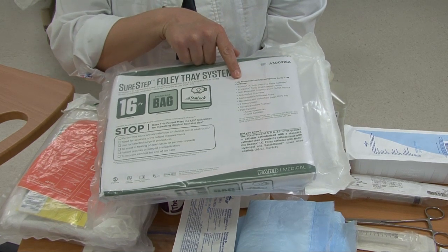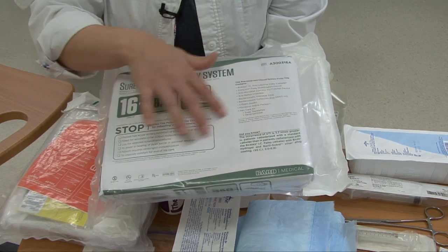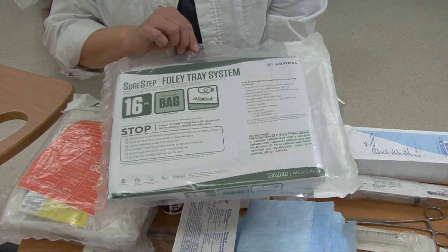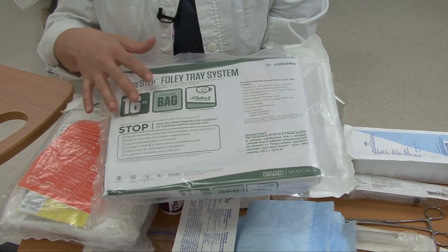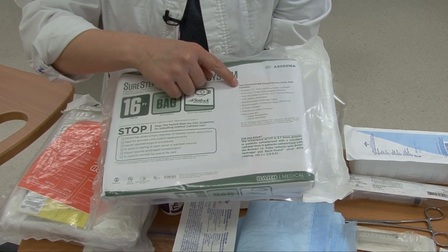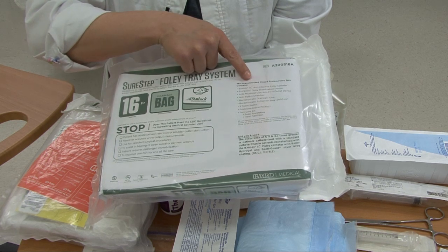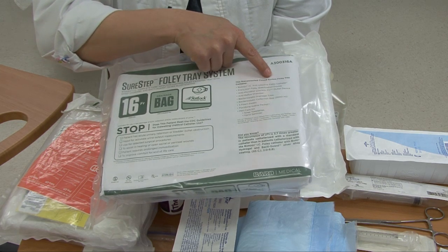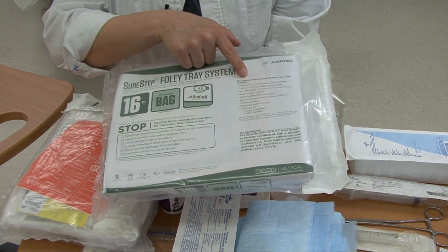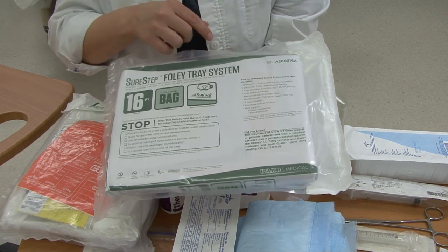You always want to examine your package before you start to make sure it is clean, dry, and intact and within the expiration date, but also review what's in it so you know if you need other equipment. This is a pre-connected closed system Foley tray. Pre-connected means the catheter is already connected to the urinary drainage bag, and it's a closed system — that helps prevent urinary tract infections.